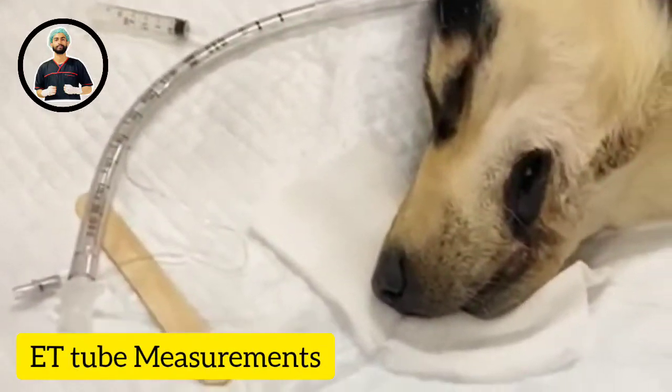Assalamu alaikum, welcome back to the new vlog. Today we have a training on pre-anesthetic procedures for dogs and dental procedures. I'll try my best to make videos of the practical class and share them with you. Let's start.